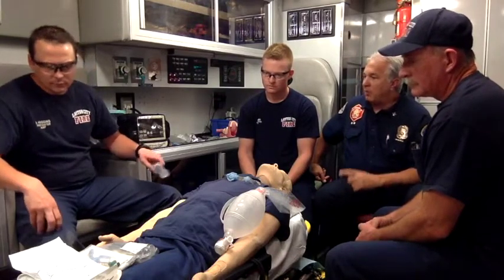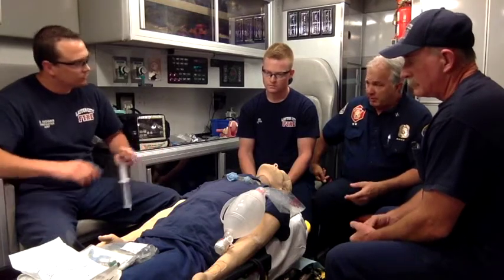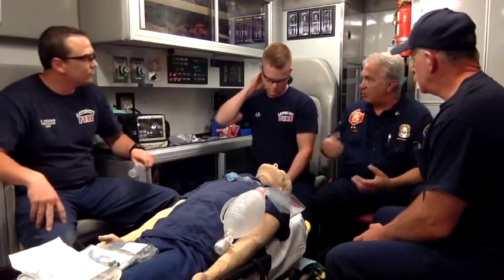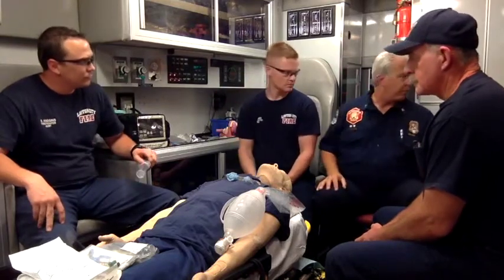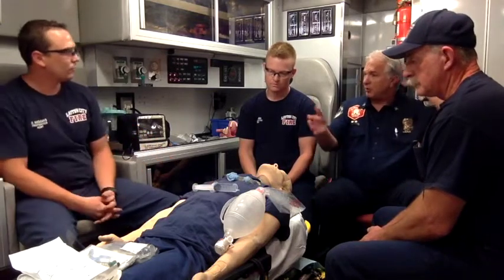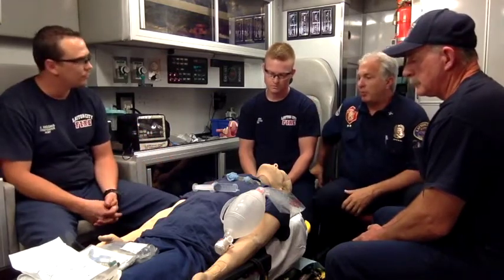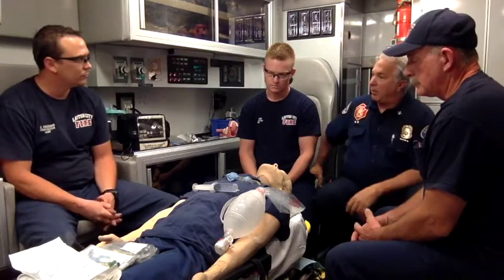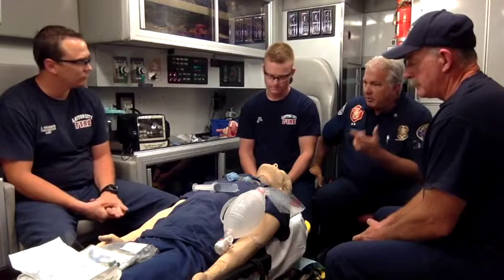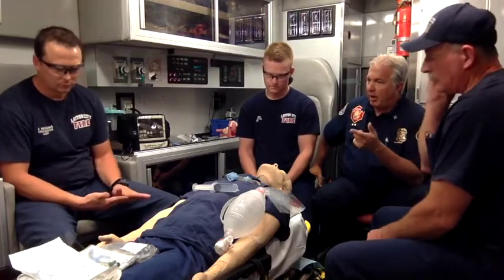But I think the important thing, especially for all of our new people, is that it would be very easy to overlook. We use the 5s, the 10s, the 1s quite a bit for all the meds and everything that we use. It'd be easy to overlook a big syringe because we so seldom use one of those. So I think it's super important that wherever we carry them, that syringe is part of the required equipment that sits right next to them.